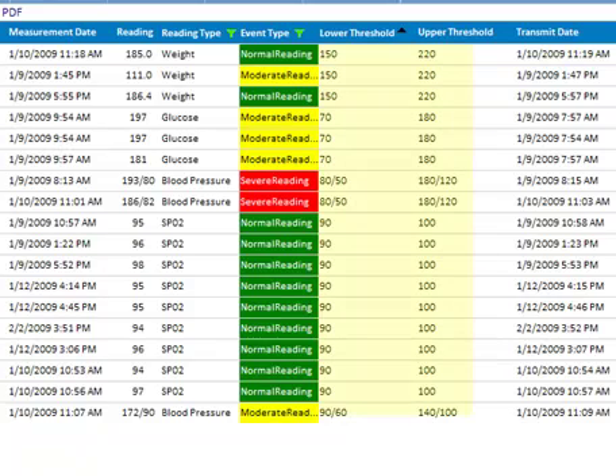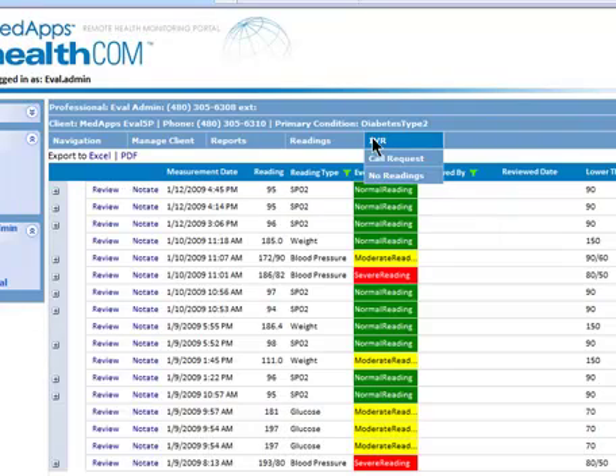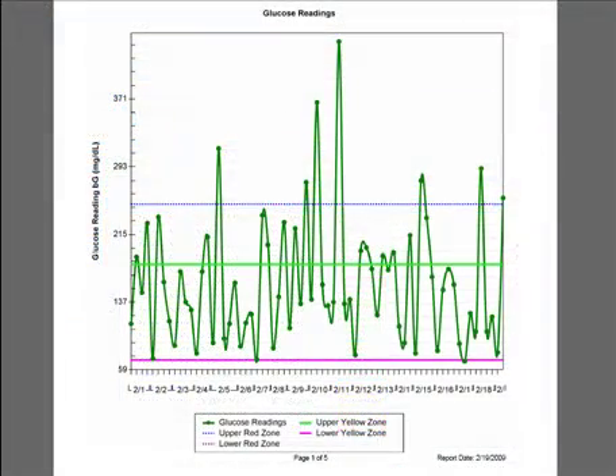Care professionals can establish thresholds and timetables for monitoring patient wellness. Readings and events can be reviewed and notated. Thresholds can be set for any reading type and can be easily adjusted. Automated calls can be triggered to serve as reminders and alerts. Reports can be generated in several formats to forward to other healthcare professionals.